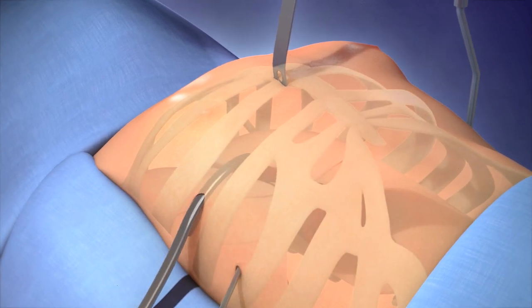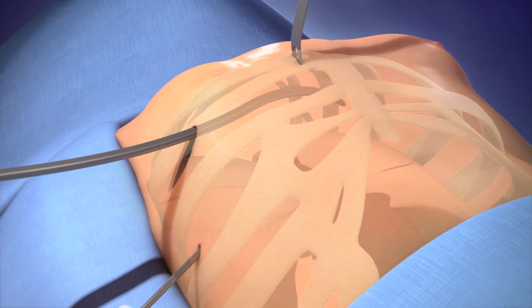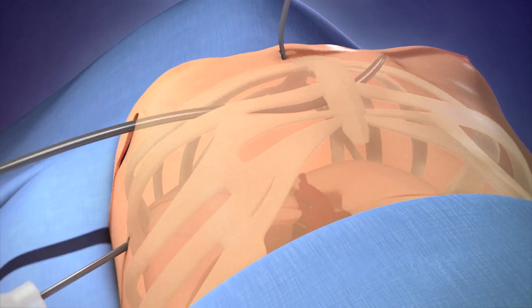A tunnelling instrument is then used to enter the chest on the right, go beneath the sternum, and then exit the chest on the left.